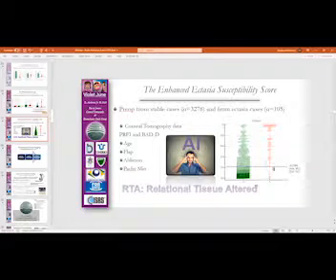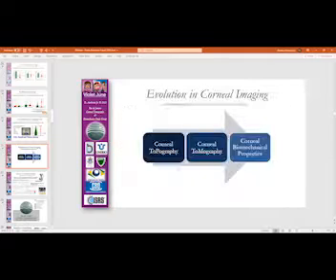And if you consider both eyes, all these cases here, the fellow eyes are here. So we can tell you it's 100% sensitive in this series. But age came as an important parameter because age is related to biomechanical properties. That's why cornea properties are important.